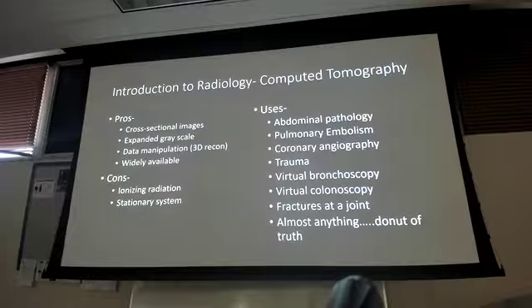What you will learn is most acute strokes don't show up on CT, even if there is a small bleed. Right, that's kind of the gist I'm getting at on that one. And if it's a massive stroke, then they're gonna be unstable because they're bleeding out of their brain, and that's gonna be a concern as well. So just use it with the vitals of the stable versus unstable for right now.